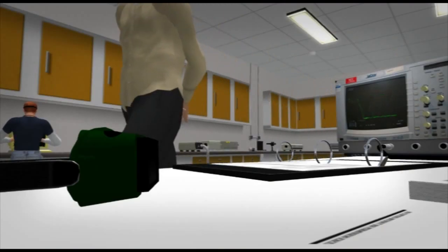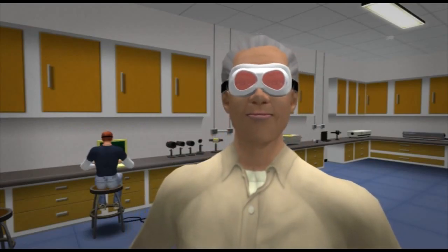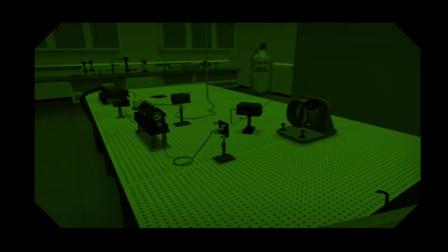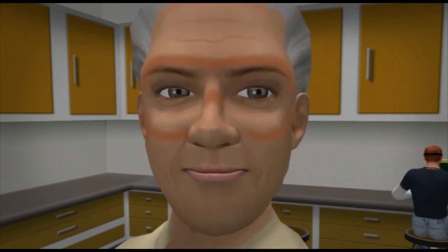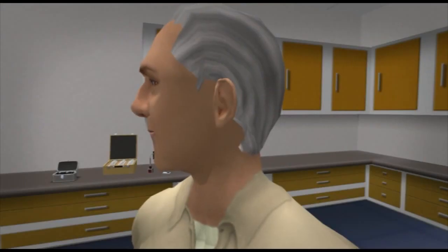There are some known issues with eyewear which we will now outline. As an extreme example, you may find some older styles of goggles restrict your field of vision. One of the most frequently used excuses for removing laser eyewear during a procedure is the discomfort felt whilst wearing it. So make sure the eyewear you use is comfortable.